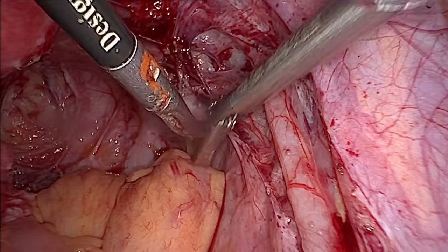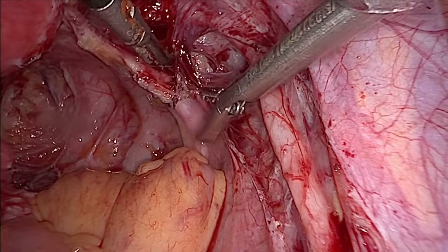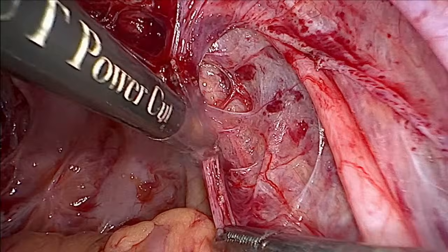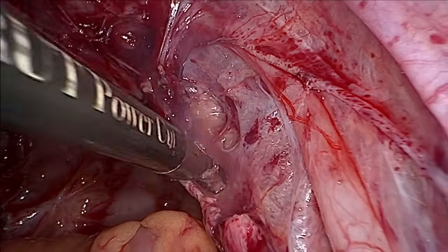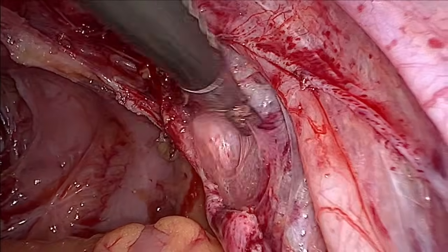Okay, so now what I can do is, okay, I can go here, can go laterally, and I will just open up this. Okay, one layer medial.